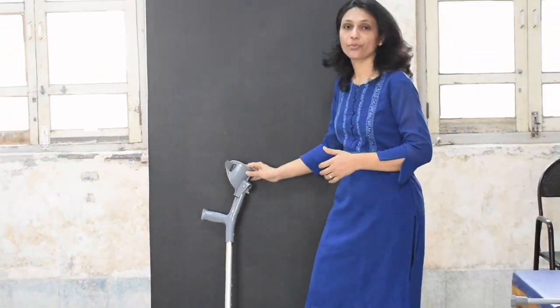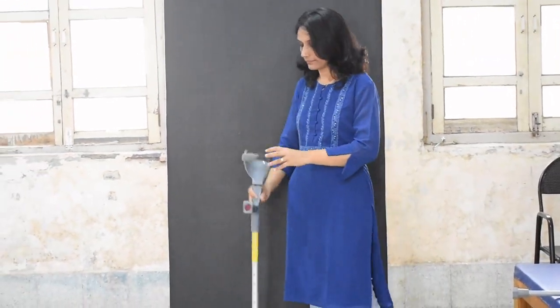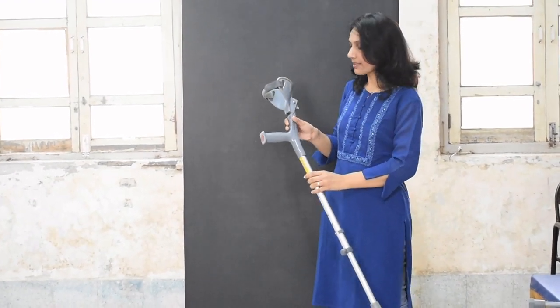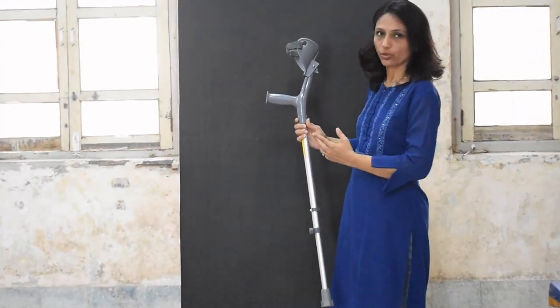This is the second type of crutch, that is the forearm crutch or the elbow crutch. Now let's look at the parts of the elbow crutch.